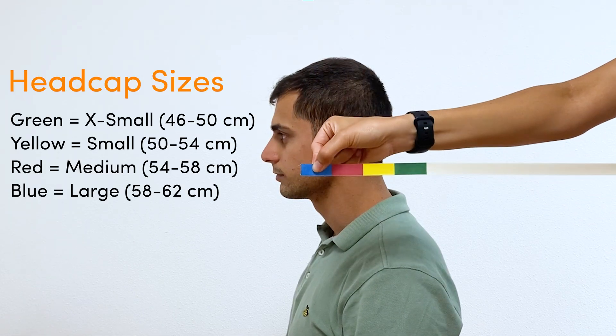Green is extra small, yellow is small, red is medium, and blue is large.